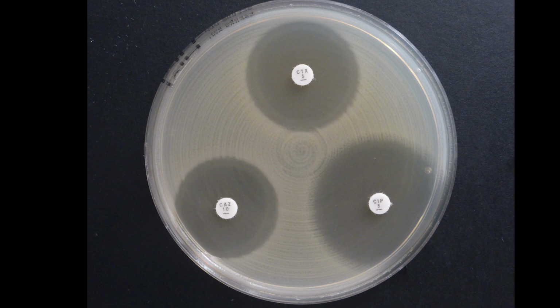And then when you are going to set up the plates to be read, you can have different aims. One could be, and that should be the main part in the beginning, I think, to train the general reading instructions. How do we read a zone when we have fuzzy zone edges? How do we read a zone diameter when we have hemolysis, beta hemolysis and alpha hemolysis? And how do we deal with colonies within zones? In this case, you can choose and focus on organisms and organism-agent combinations that are important to you.